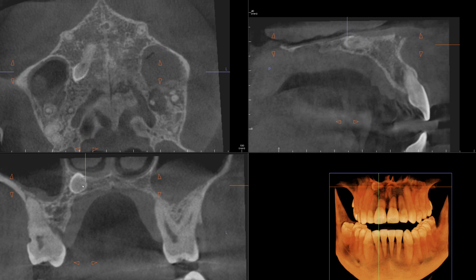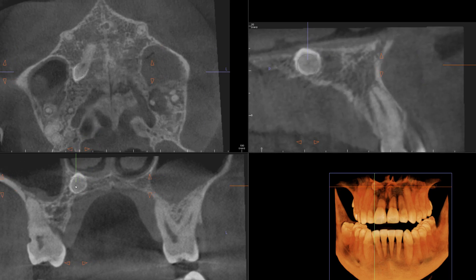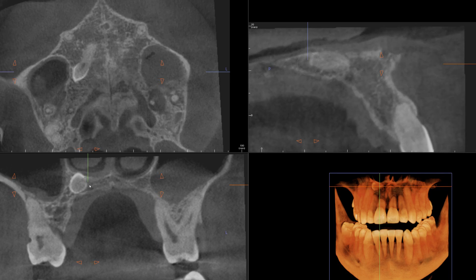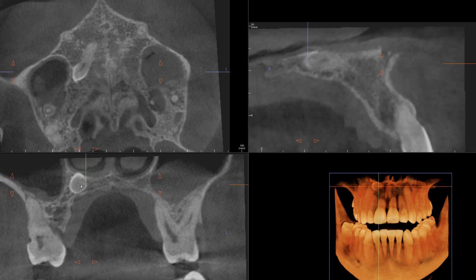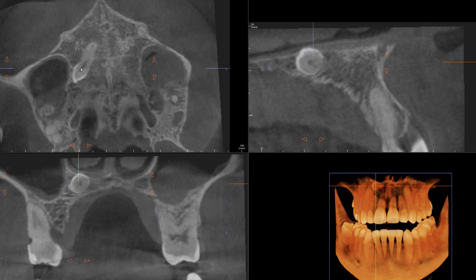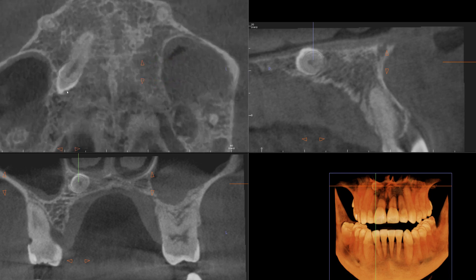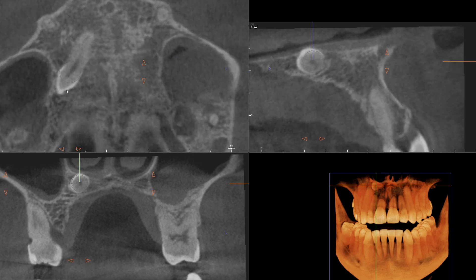Let's also take a look at this in the sagittal view as well. One other feature I would like to point out is that as you evaluate the root outlines as well as the enamel layer, you're going to see some areas that show irregularity along the enamel.